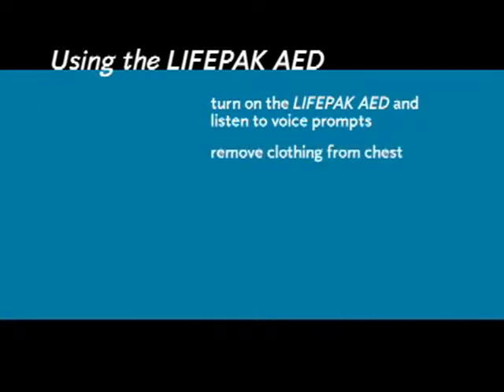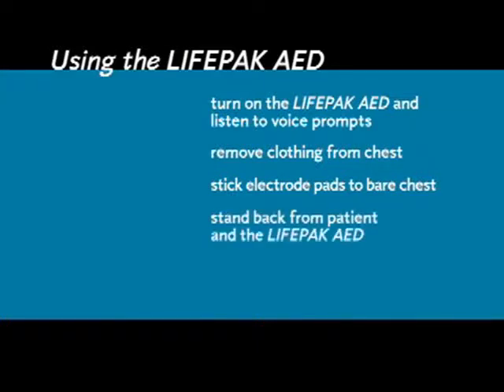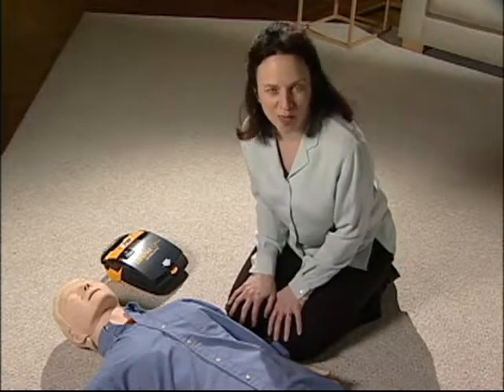Strip the clothing off the patient's chest. Open the electrode pads and stick them to the patient's bare chest. Once you have the pads on, stand back while the Lifepak AED decides whether a shock is needed. After that, the AED gives you more instructions for what to do until the emergency medical team arrives. Okay, let's go through that in detail.